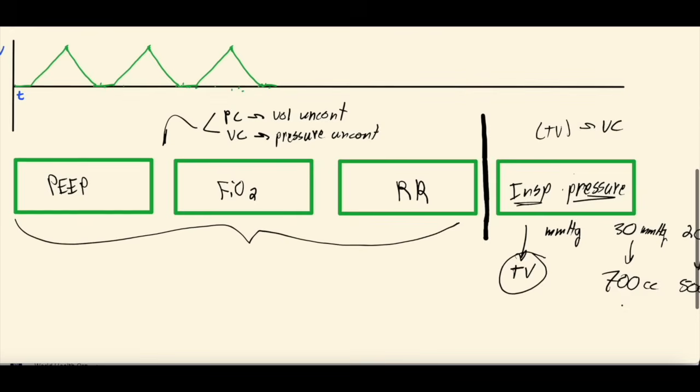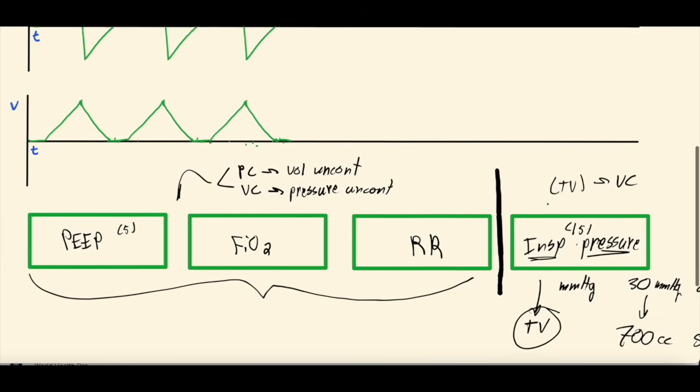And most of the time, and this is ventilator dependent, this is the pressure above the PEEP. So let's say I set this at 15 and the PEEP is at 5. That means the total pressure they're getting with each breath is 20, 15 plus 5. Again, a little ventilator dependent. Okay, so you're setting an inspiratory pressure in pressure control. You're controlling the pressure. How do we understand that with the scalars?